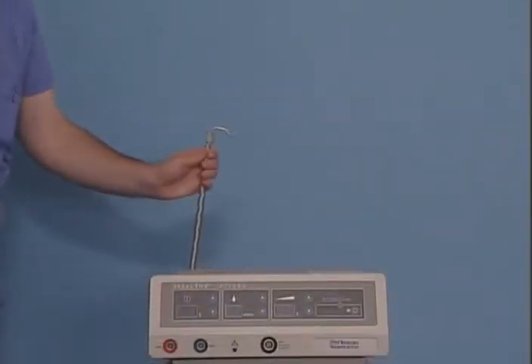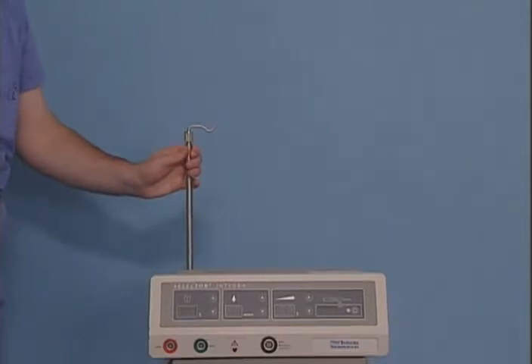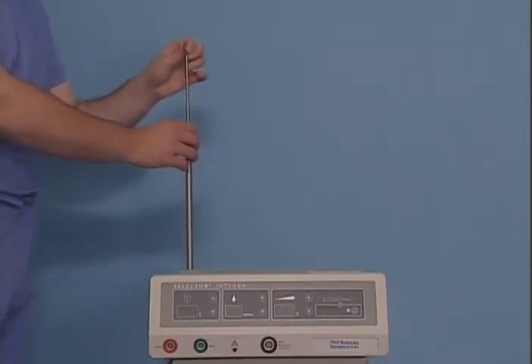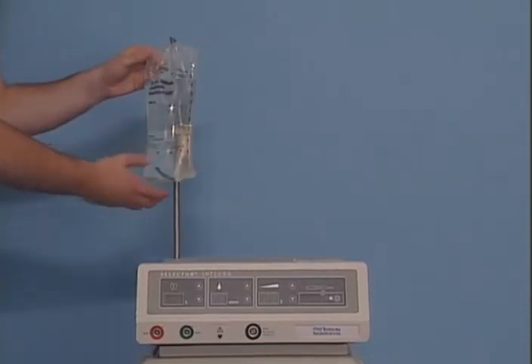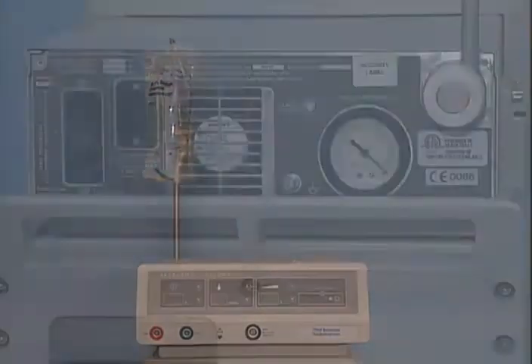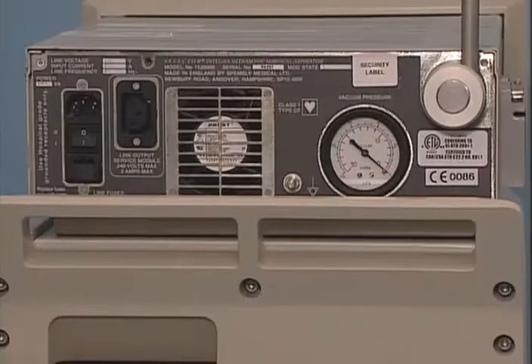On the console, lift irrigation pole and pull to desired height, securing by turning knurled locking ring clockwise. Hang an IV bag of normal saline or lactated ringer solution onto the hook. Turn on the power by flipping the switch, which is located on the left rear panel of the console below the mains inlet.